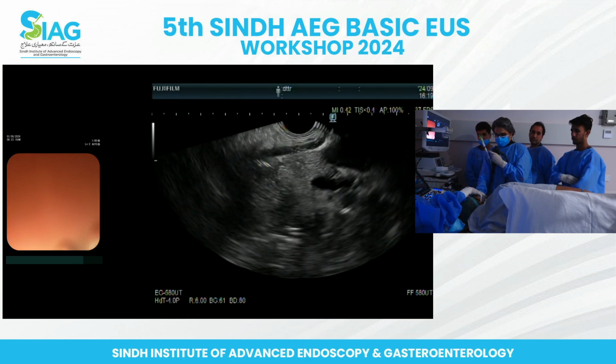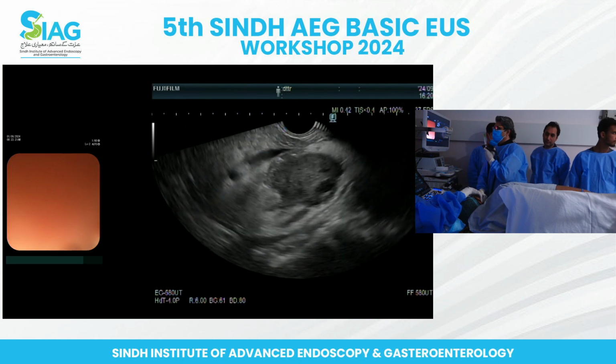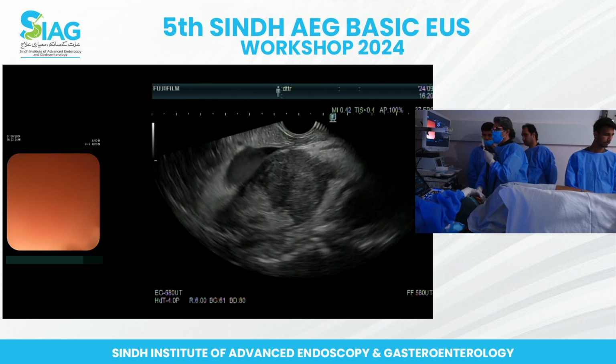So she's retching at this point. It'd be helpful if we could sedate her a little better.